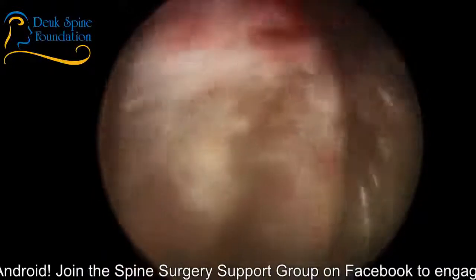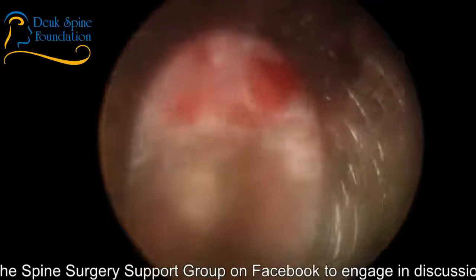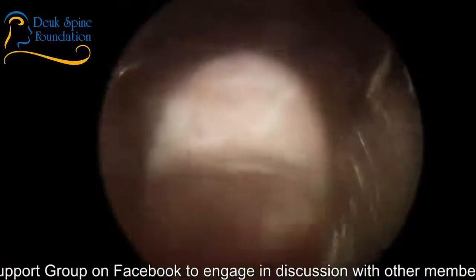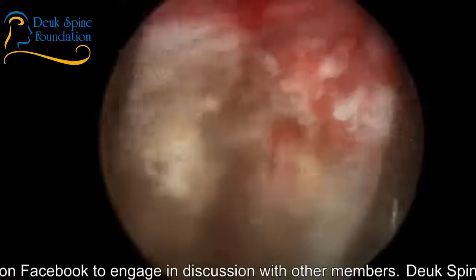All right, we've gotten rid of a lot of the bone spur. At 12 o'clock is looking at the next nerve. There's the nerve root right there. You see the white thing? So we're just underneath it. A little bit of bleeding from epidural vein and bone spur.